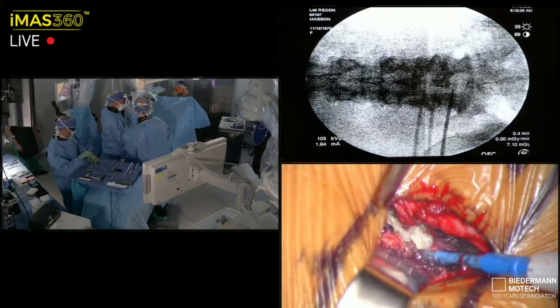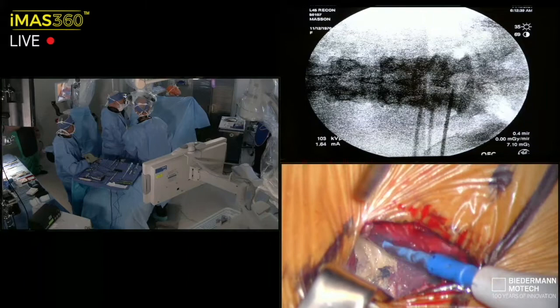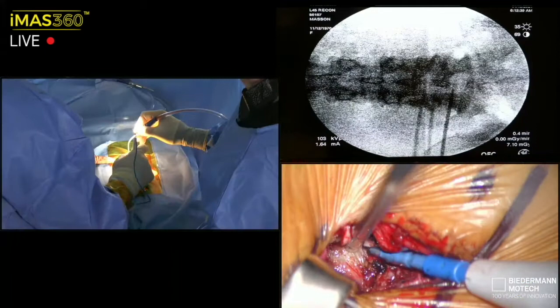Yeah. All right, so you can see the scar tissue. I'm just dissecting down. I leave a muscular cuff dorsally, but as I get deeper and deeper, I go more and more lateral. I always do a fascial split that takes me a little higher than the skin split. That'll give me the opportunity to have less muscle retraction.